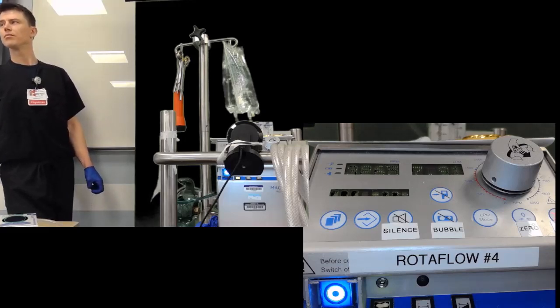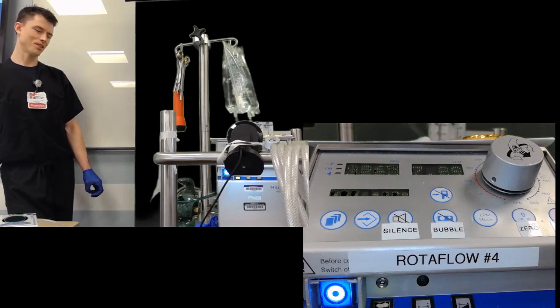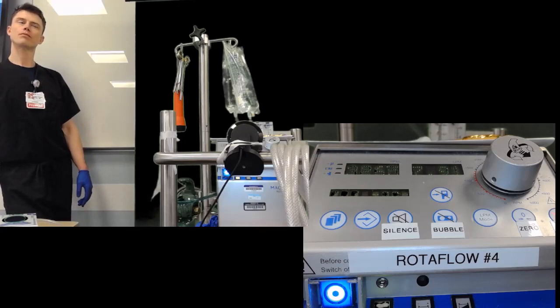Poor Renee, I think overnight had that patient where it caught on fire or exploded and it overheated the patient. Oh my God, yeah. I couldn't hear about that. We try to put that out of our minds. There was a malfunction with the heater. Nothing anyone was doing wrong. It was actually not the K-pad heater, it was the heater that comes with the ECMO circuit, and it overheated and caused the fever for the patient. And she started bleeding, and her temperature was like 107 or I don't know. It was really high, briefly.